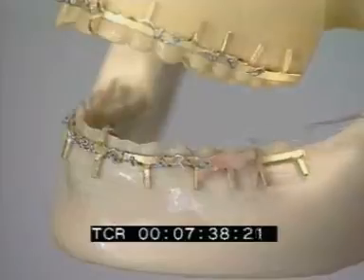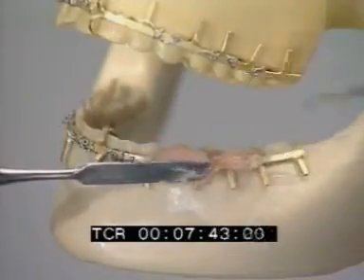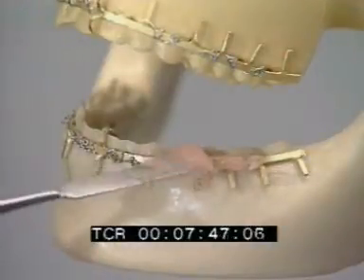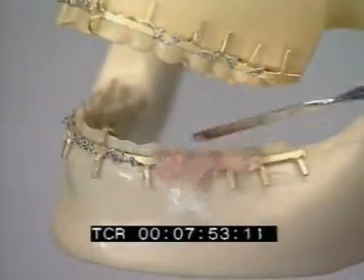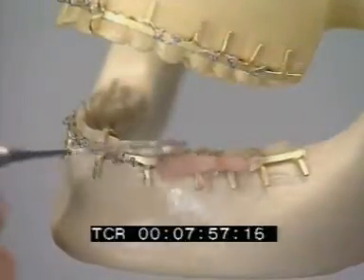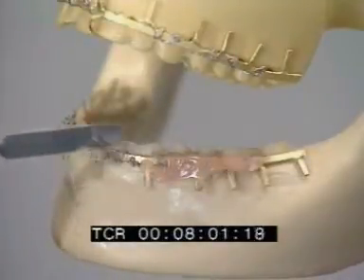A spatula is moistened with monomer and used to mold the methacrylate. The objectives are: first, to protect the elastic wires against loosening under function. Second, to keep the wires in the correct position so they do not migrate onto the gingiva. And third, to cover all sharp wire ends as protection for the surrounding soft tissues.